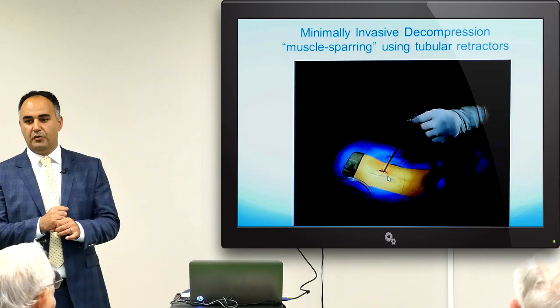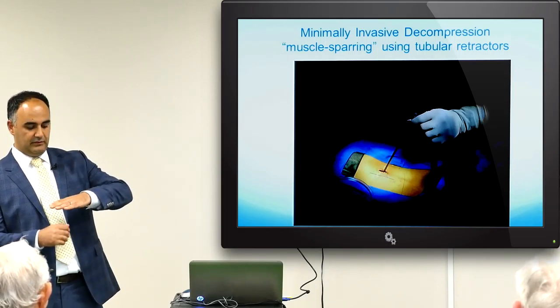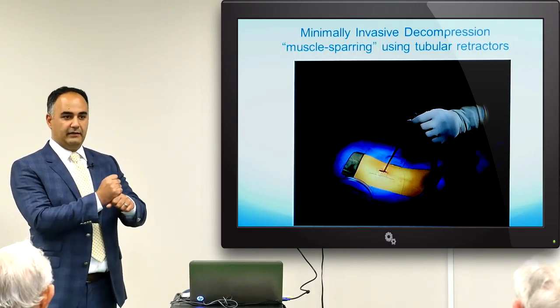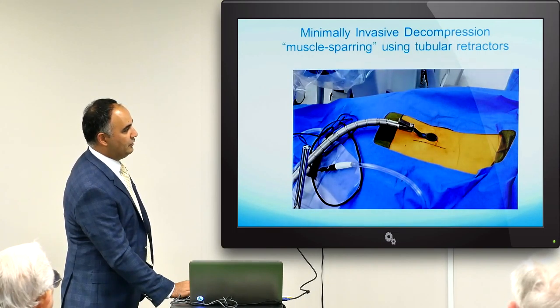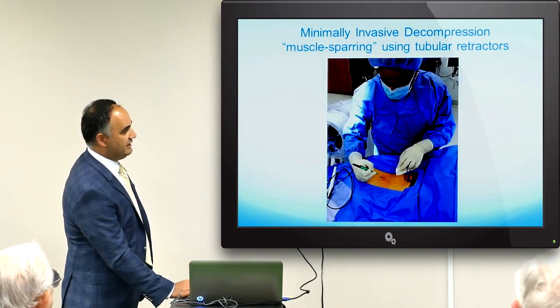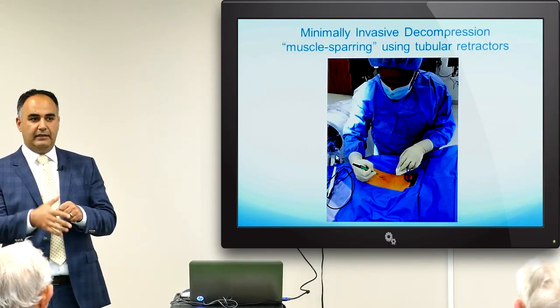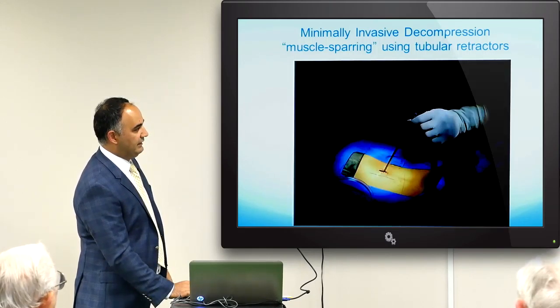This is that probe I was talking to you about. We make that incision, I put the probe down, I can feel the spine. And the spine's shaped like they're shingled on top of each other, so you can kind of ride up one and know where you're at. And to confirm it, we don't just do feel, we get x-rays. That big machine you see here is our x-ray machine. So once I put that right where I want it, I get an x-ray to make sure that's where it is, and we proceed with the surgery then.